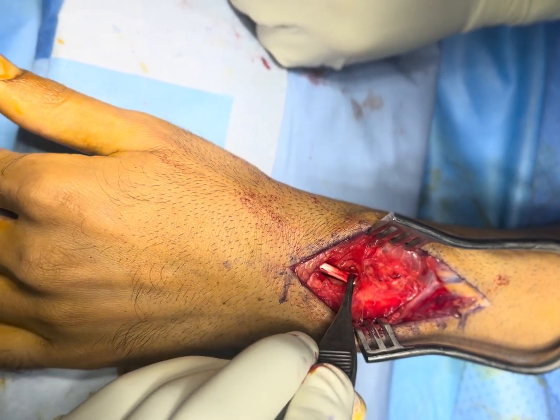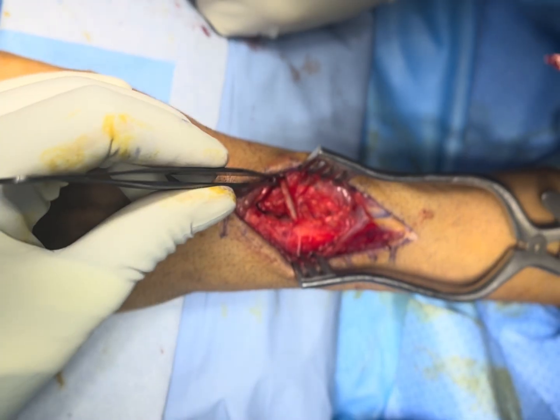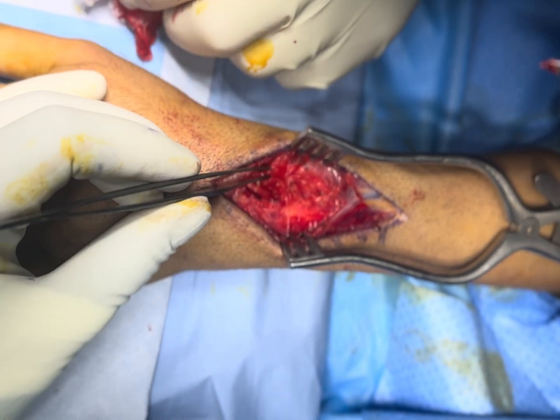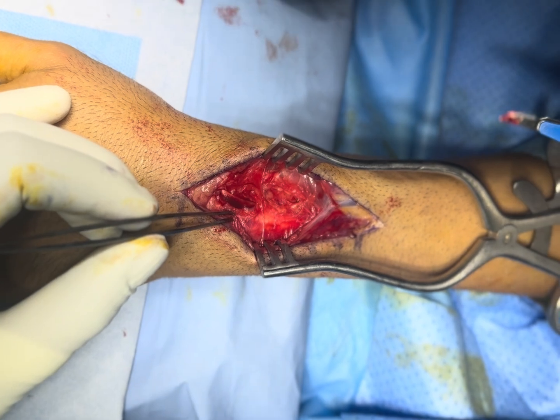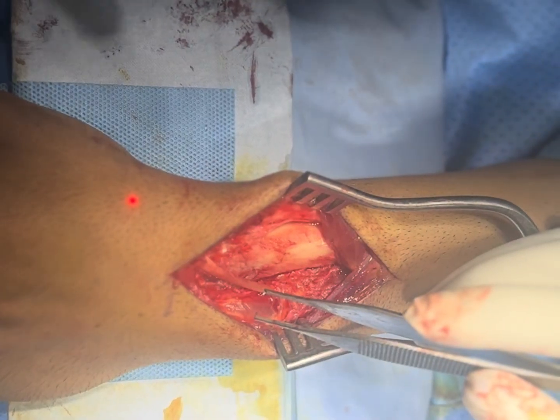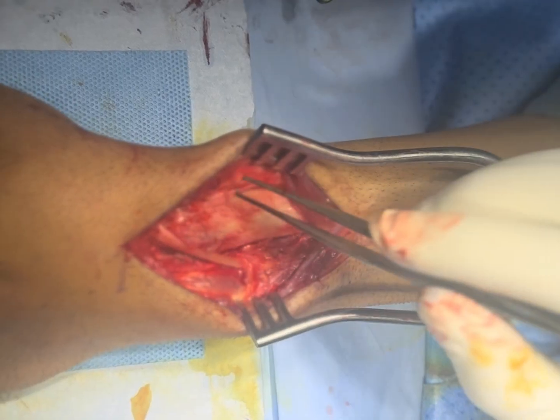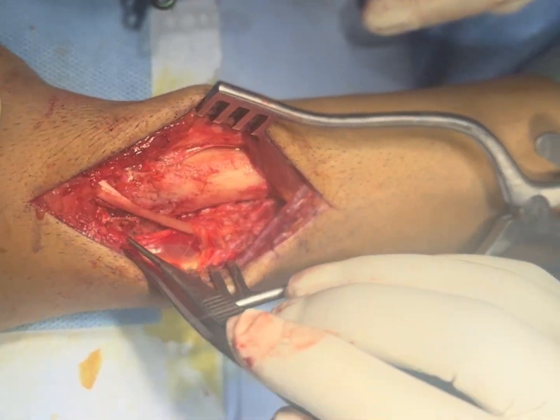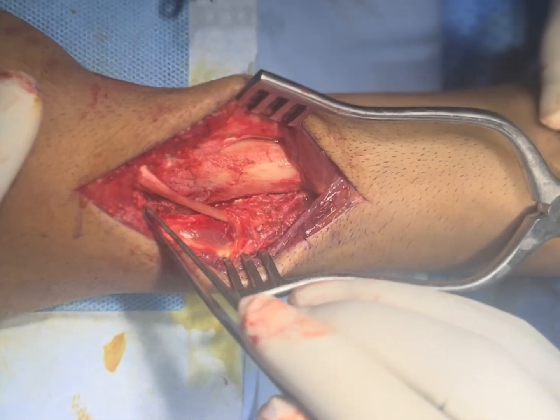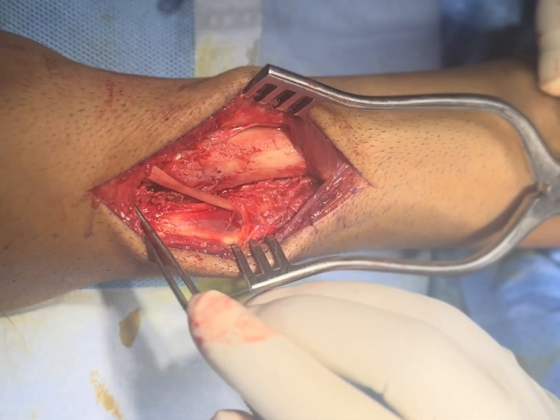We will deflect the tendon laterally and then expose the second and fourth dorsal compartments. This is the EPL tendon and this is the Lister's tubercle — we have created the two flaps. We did a capsulotomy to expose the joint, but I am not finding too much particular intra-articular injury.